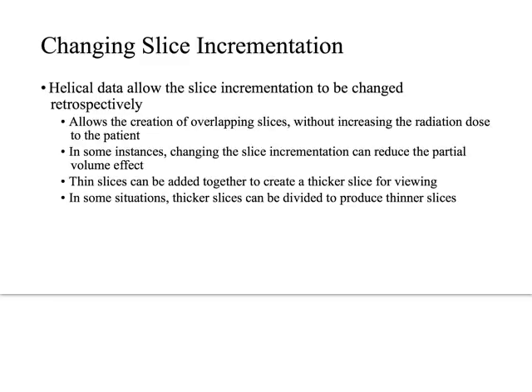What's interesting now that we have this data set, so let's take a step forward and ask the next question. We've got our helical data set. We have the power now, since we acquired a chunk of data, and it's not just hot dog slices, it's all this solid chunk of data.